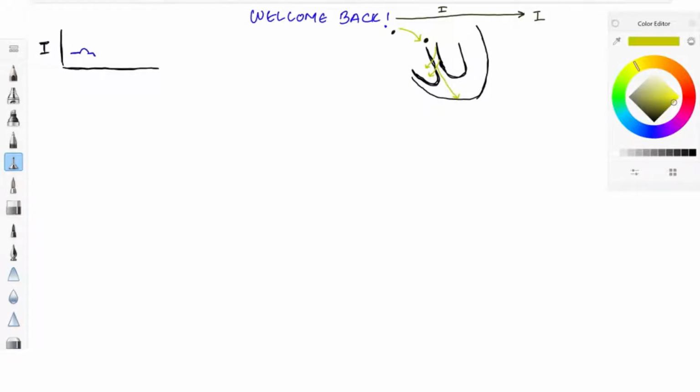After which you get a positive R wave. And then when the current goes into LV, it's going to be a negative deflection, and then you get an S wave as well. When the current finishes, it comes back to the isoelectric baseline. You've got a delay, and then you've got the repolarizing current going outward to inward, negative going towards the negative pole. So you've got a positive T wave.